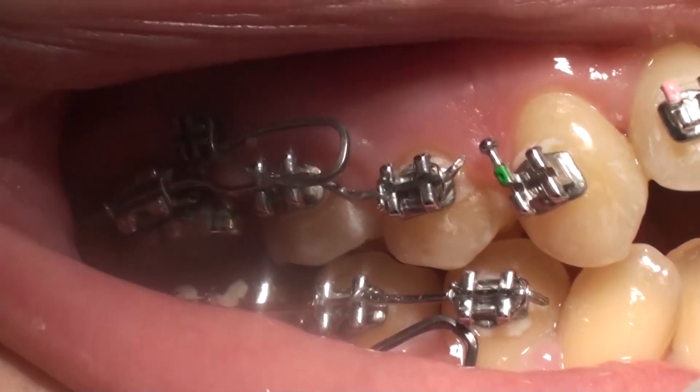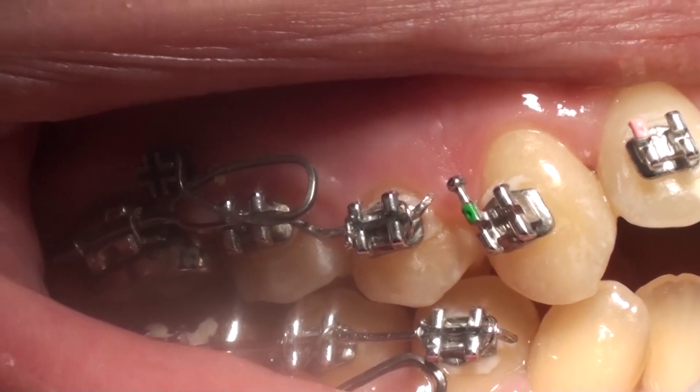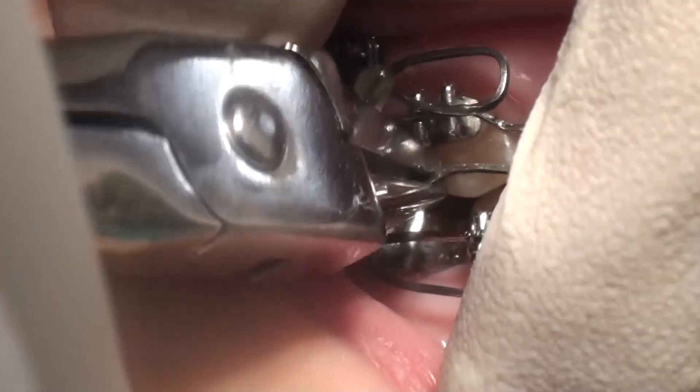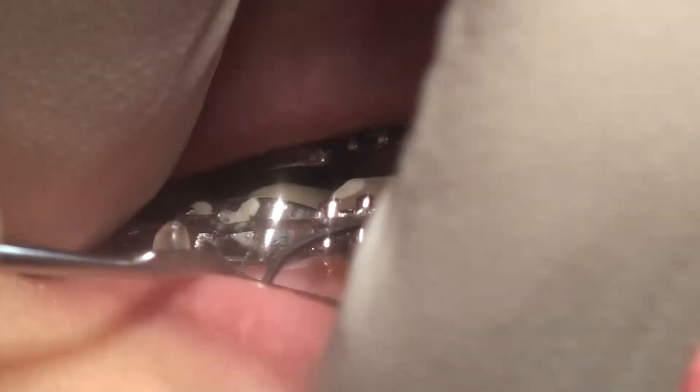This way it is delivering an intrusive force to the teeth, which include the 2nd and 1st molar and 2nd and 1st premolar. The teeth are also having a passive TPA — transpalatal arch and lingual arch.